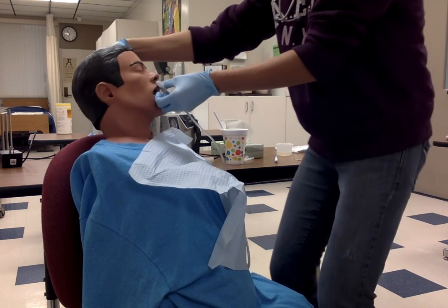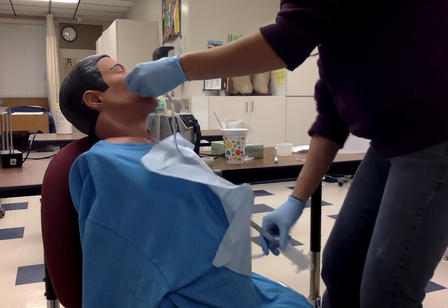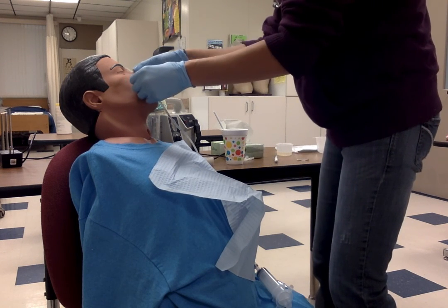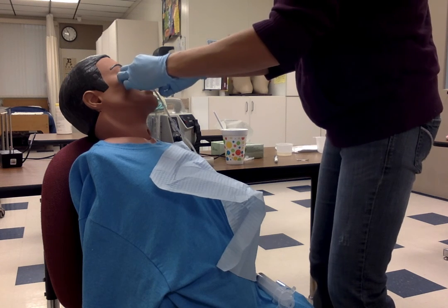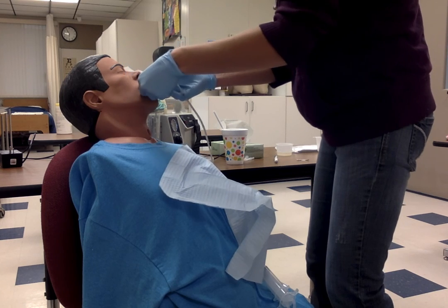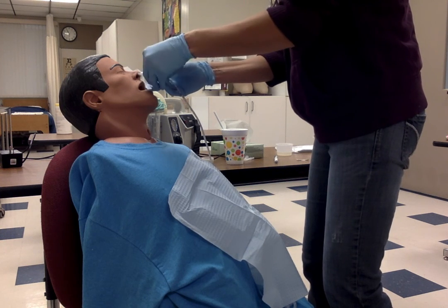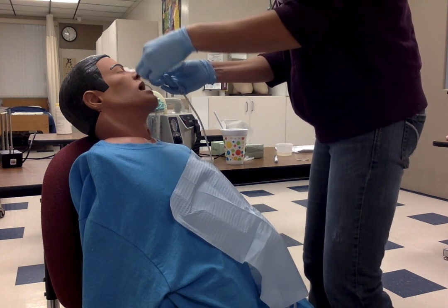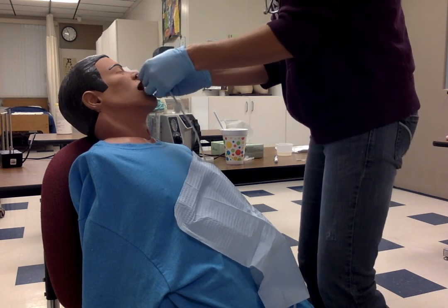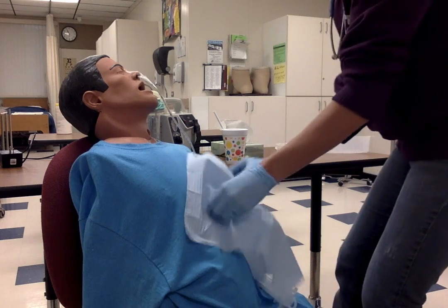Okay, so I would take the patient's water cup here. I have it here. And for my demonstration purposes, I want to go ahead and get this secured right away so that it doesn't fall out at all. So I'm going to tape it on the nose here. And you just go around one way and then around the other way. All right.